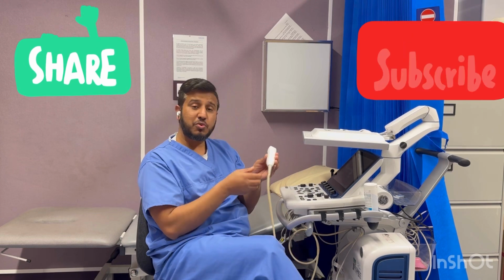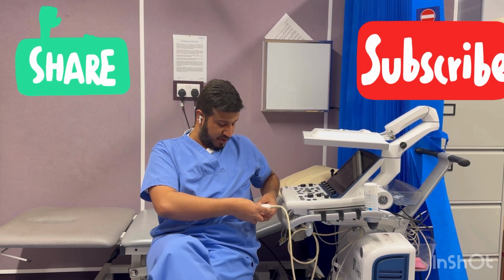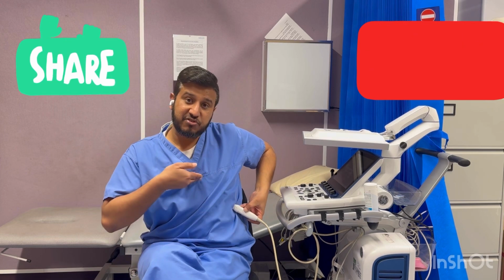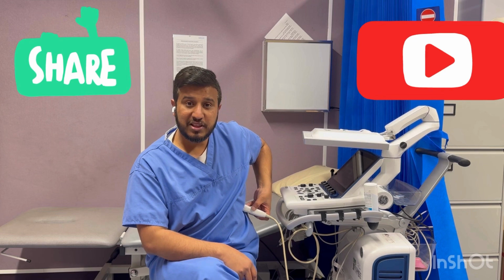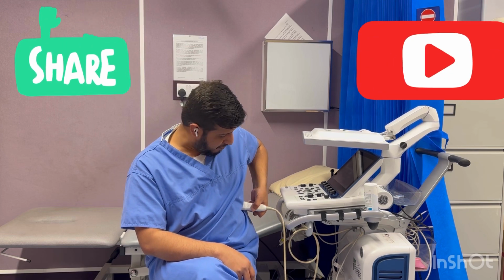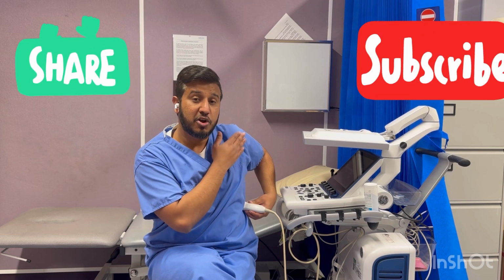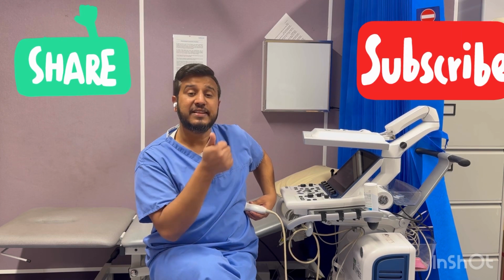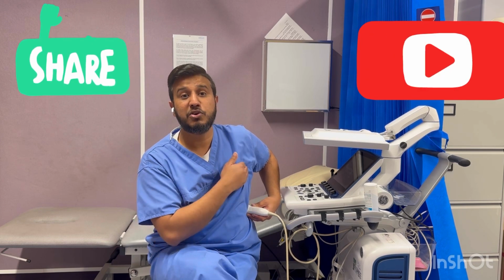So once you get the first image, you angulate your probe like this, and you get the image this way, and this is your apical four-chamber. Once you get the four-chamber, then you move your marker by 90 degrees. When your marker is facing towards your left shoulder, that will be your apical 2-chamber view. Your marker will be at 12 o'clock.